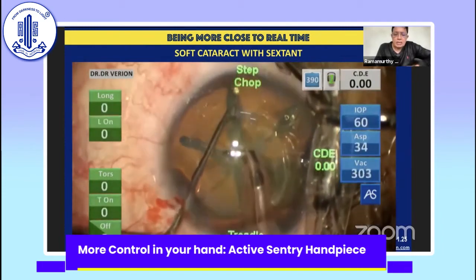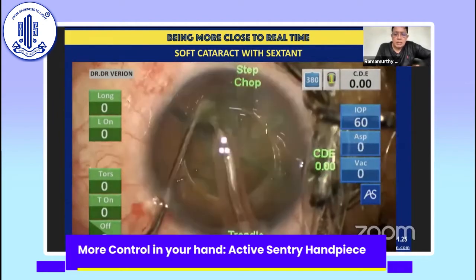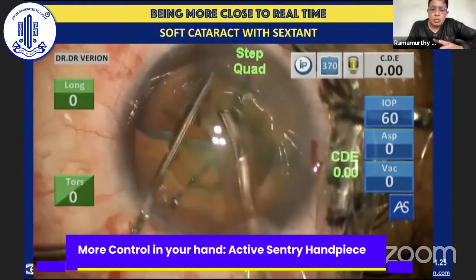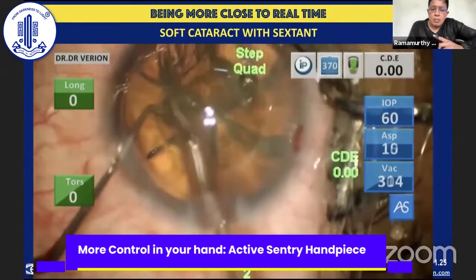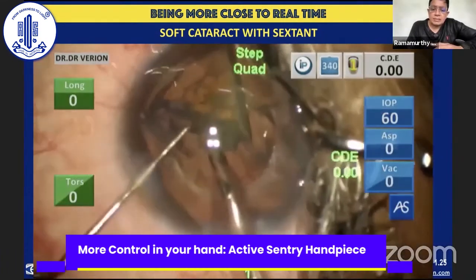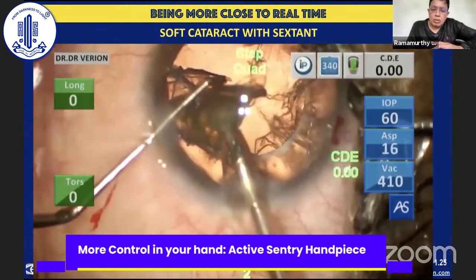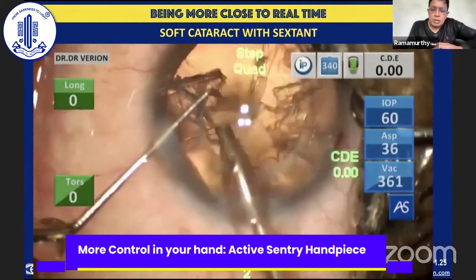I find that in my hands, at least, this separates the fragments into complete pieces. And you can see the CDE will remain 0 right through the surgery, because really you don't require any phaco power in these cases. But this is exactly the situation where the soft lenticular material tries to clog the phaco tip. We were talking about not having complete occlusion, but these are the situations where most often complete occlusion does occur, because there's no phaco power being used, and the soft material completely occludes the phaco tip. And often these are young patients. You have to be extremely careful that you don't damage the posterior capsule or cause any damage to the endothelium. Even though you're not using any phaco power in these cases, it is possible for these to happen.